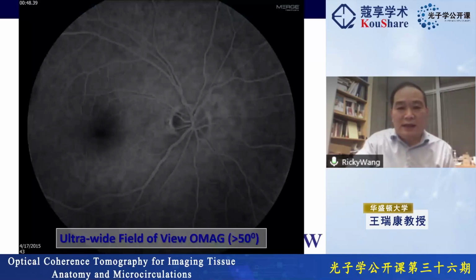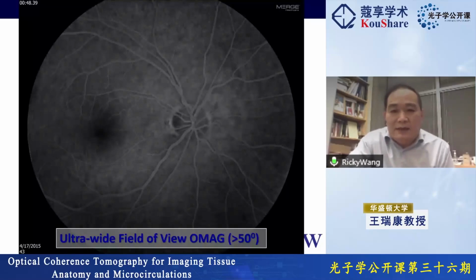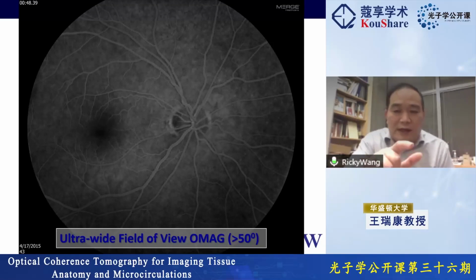I'll give you an example of the wide field of view scanning, and this is my eye. The gold standard to look at the vasculature in the back of the eye, basically in the retina, is the fluorescein angiogram, FA for short. If you use the FA to contrast the blood flow in the retina, you have to inject the dyes into your bloodstream, and then use the camera to capture the fluorescence.